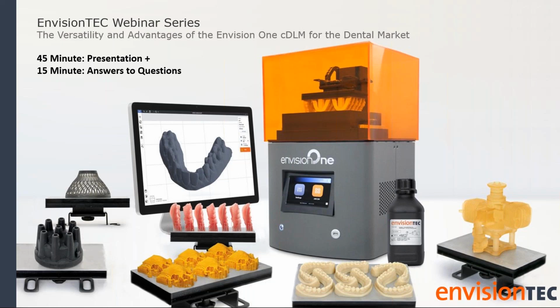If you go beyond 300, you might have excellent results for 50, 100 prints after. But we like to have that safety net of 300 because we want to make sure you are providing your dentists the highest quality of models. After 300, it could possibly start to waver.